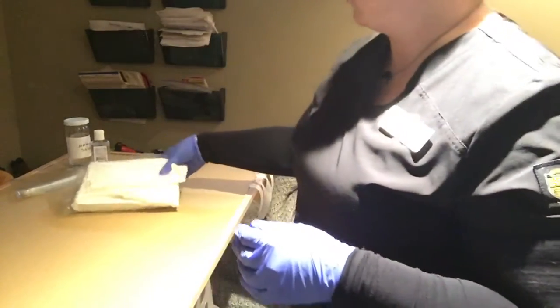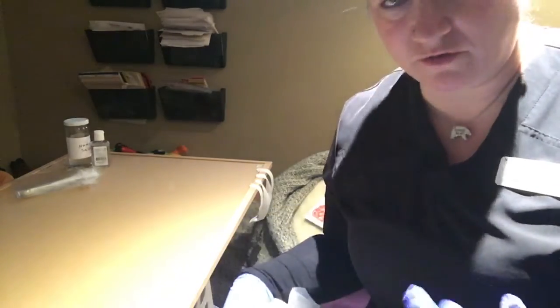I've got my sterile field here. With regards to this, we want to make sure that it's not contaminated. We want to check the expiry date. We want to make sure it's not wet. And we want to make sure that there's no holes or that it hasn't been damaged. Okay? I'm going to take the package off.